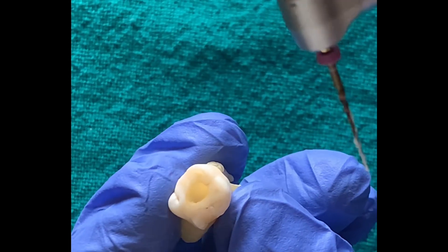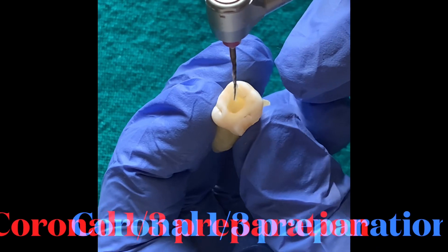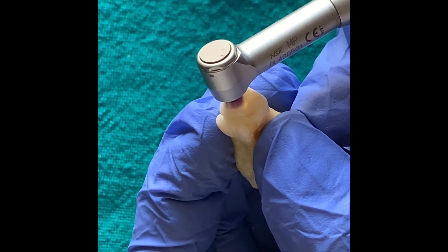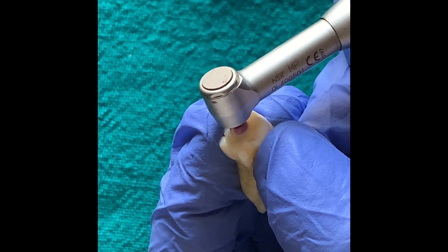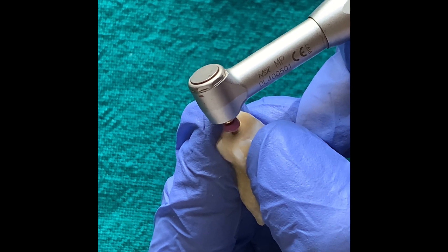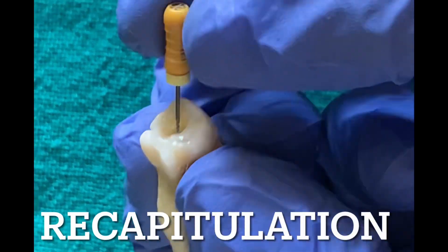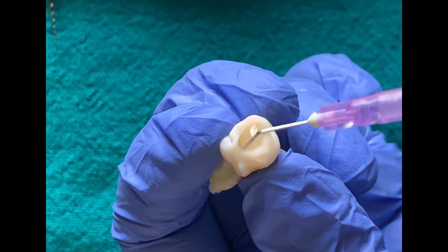Working length is marked on the S1 file, which is coated with lubricant and placed in the canal. This file is allowed to passively float in the canal and follow the glide path. These shaping files are used like a brush — they cut on the outstroke, cutting laterally as they are pulled out. From the irrigation, you can see the amount of debris that has come out, confirming active cutting took place. Recapitulation is then done with a number 20 file.